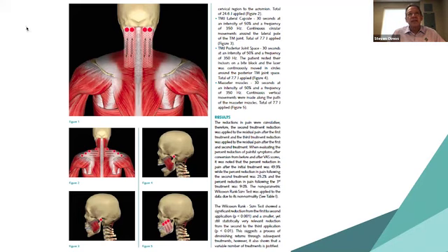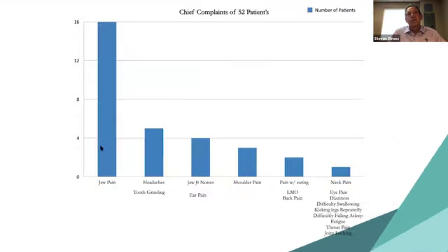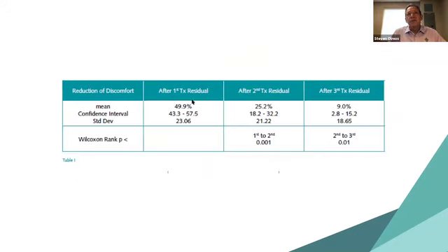Whereas the other patients tend to get the temporal headaches in the morning, that's mouth breathing, and then of course, elevator muscles. So we do a minute on each side of the extensor muscles, and then we do a minute and a half for the shoulders of the trapezius. We do 30 seconds for the posterior joint space, lateral, and 30 seconds with the masseters. And in that, we were able to reduce jaw pain significantly. In our study, jaw pain was the most predominant problem. And we were able to reduce that almost 50% in the first treatment, 25%, 9% until we had resolution.